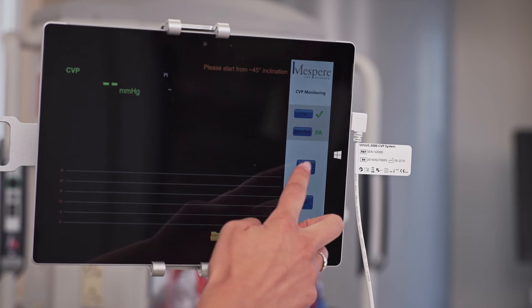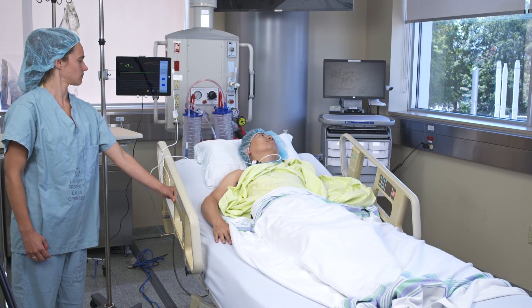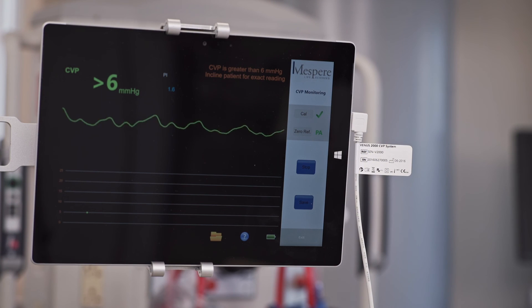Press the start button on the monitor and wait for instructions to appear in the message center on the screen. Follow the instructions on the screen. Recline or incline the patient until an exact CVP reading and waveform appear on the screen.